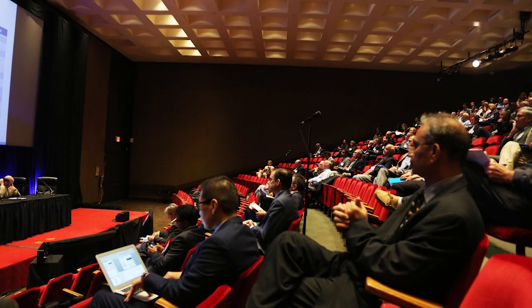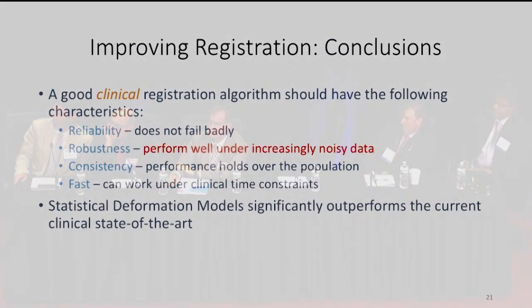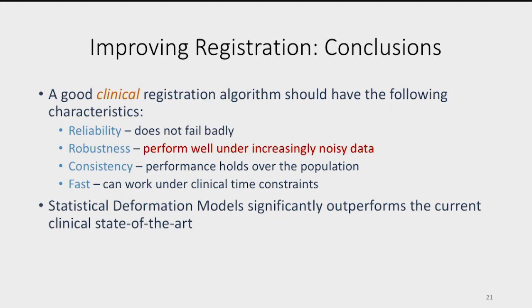I'm not talking about needle deflection. I'm talking about the prostate gland. No, that's what we're saying. We realize that's exactly what you're saying. That's what we're talking about. It doesn't have that, as long as you control what's going on. And then you control as the biopsy goes in terms of the swelling. So you're always having to come back to your initial ultrasound registration.